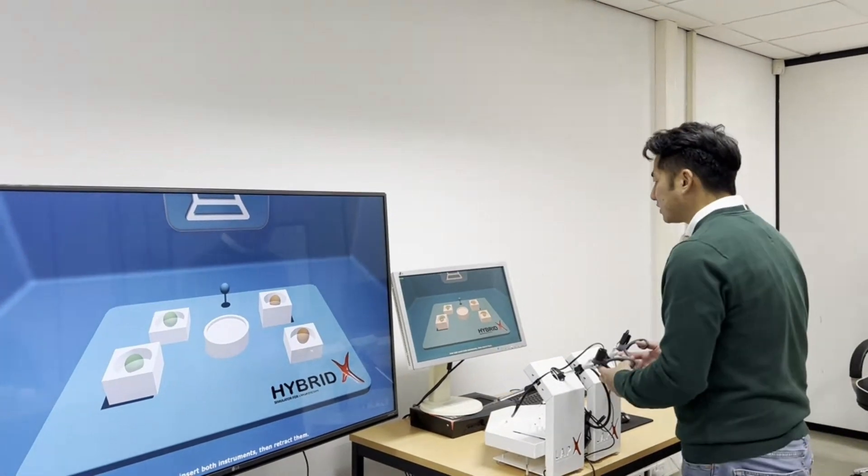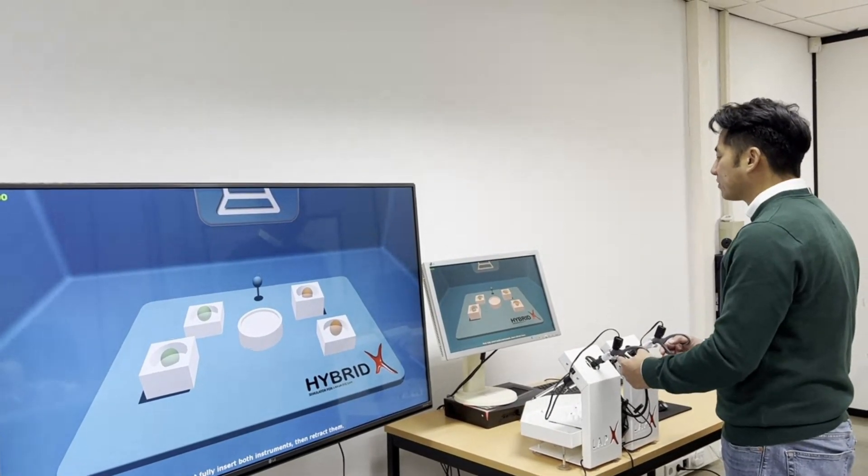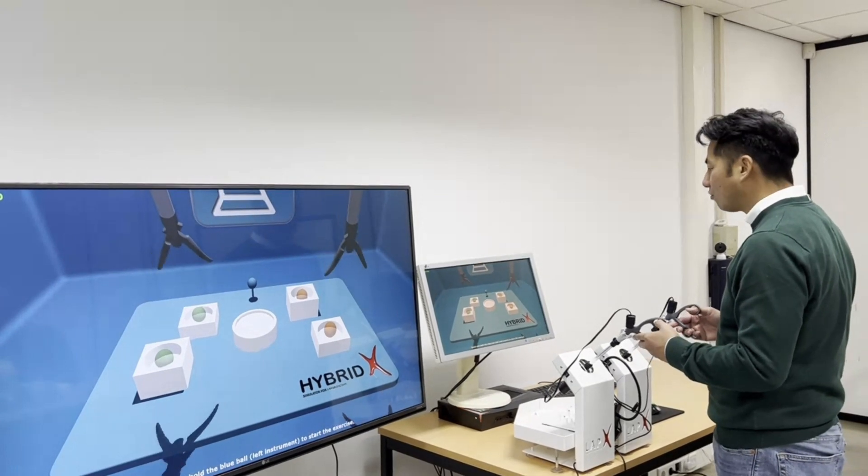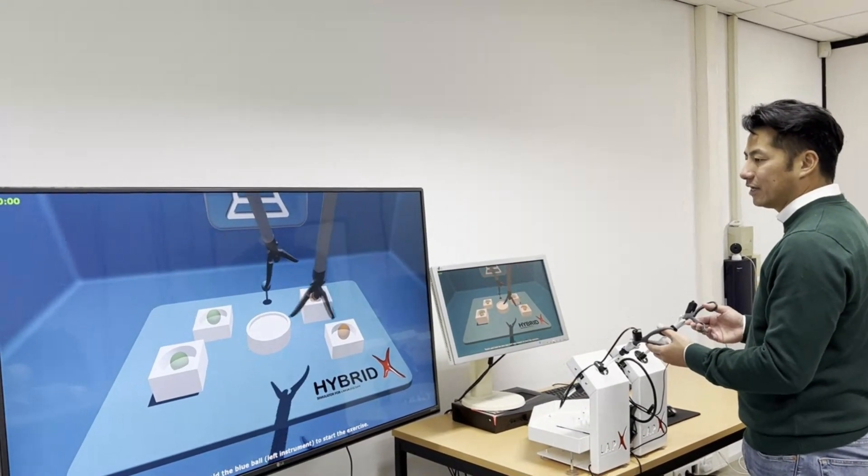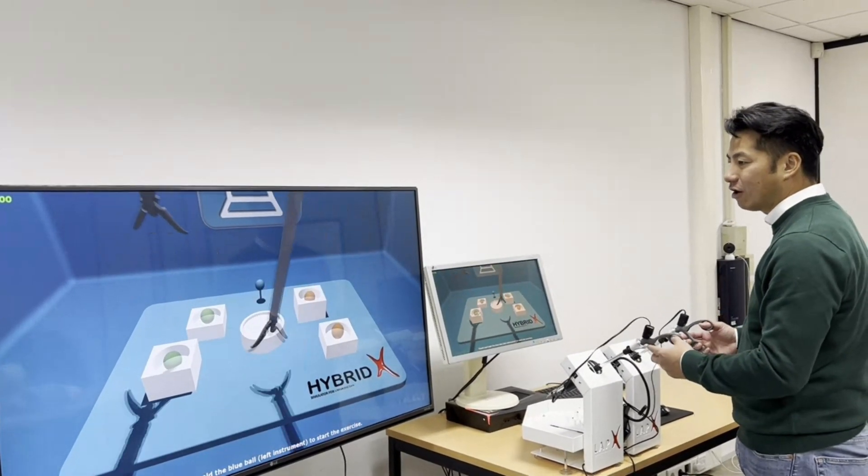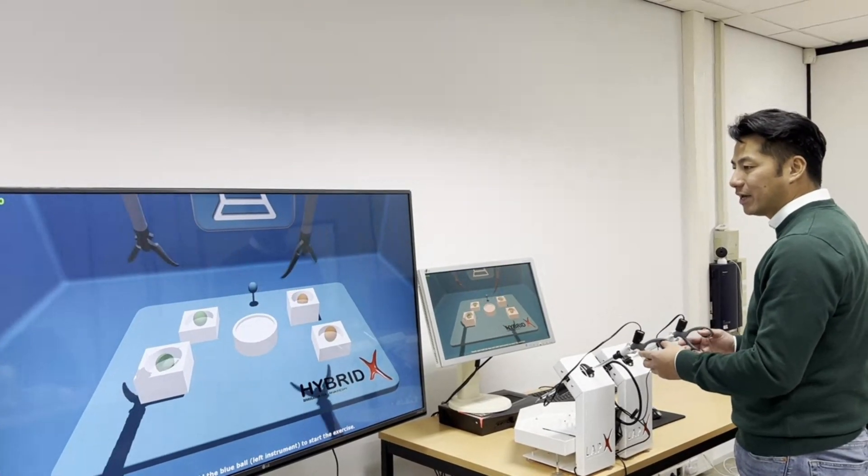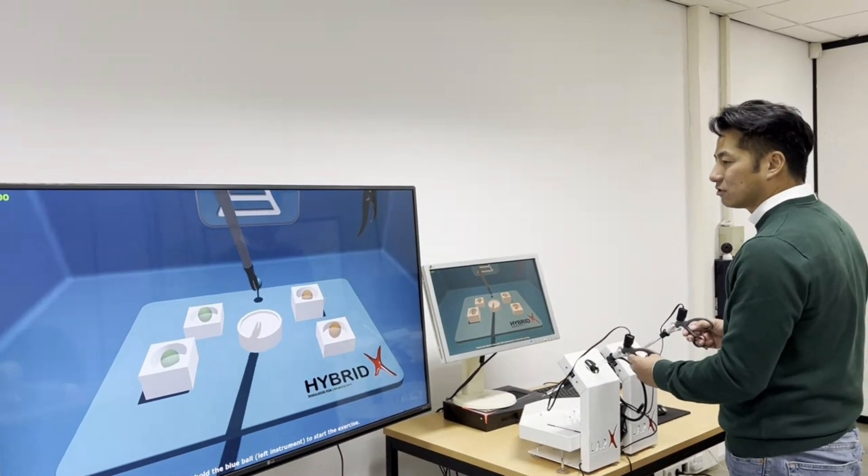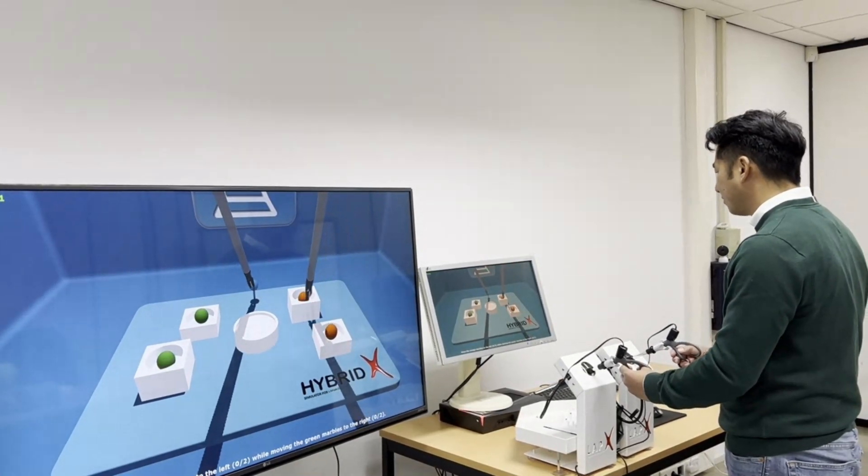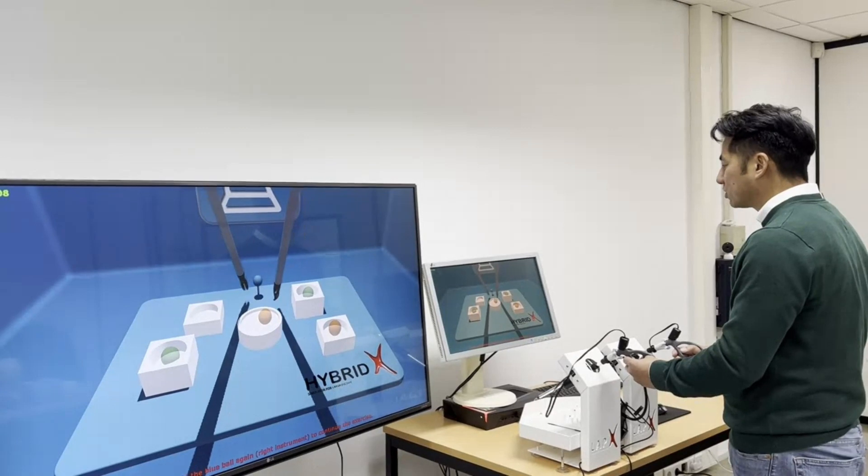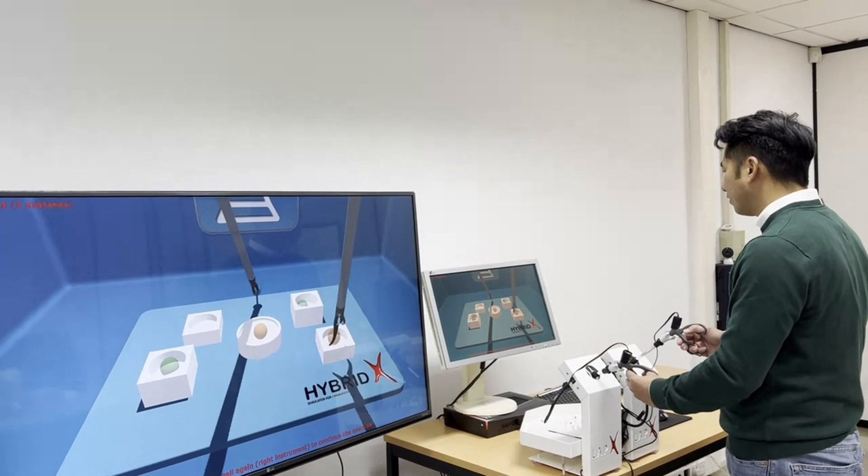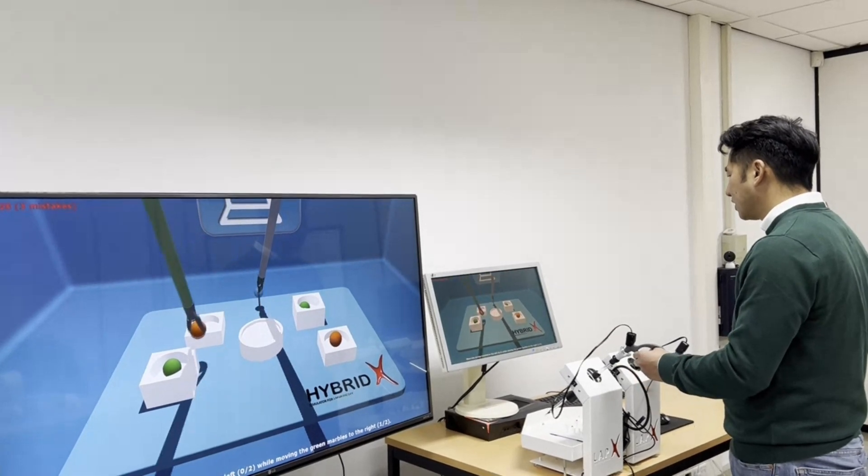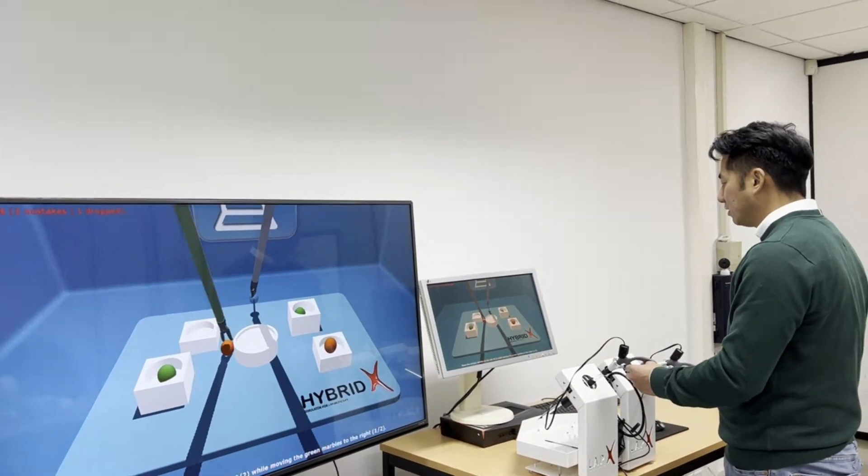Now let me open the exercise. So in this particular exercise it's all about the hand eye coordination and what you need to do is you have to put all the green marbles at the location where the orange marbles are and vice versa while with one hand you touch the blue marble in the middle. And as you can see here in reality I'm holding the real instruments and in the VR environment you see the instrument mimic the movement that I make. So it's very realistic it's almost like a computer game. So now I touch the blue marble and then I can move an object. And when you make a mistake for example you touch the background the simulator will make a sound and it will be counted as a mistake. Or also if you accidentally drop a marble it will be counted as a mistake as well.